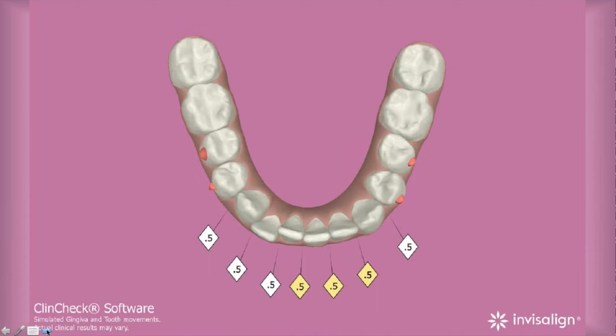No, they're not. You look at those 5, you're supposed to be doing your IPR right there. Are the teeth straight? No. That means the chances of you resolving the contact between 25 and 26 is very low. The chance of you getting 26 to lock in where it's supposed to be is almost impossible, because every aligner is pushing it into a collision.